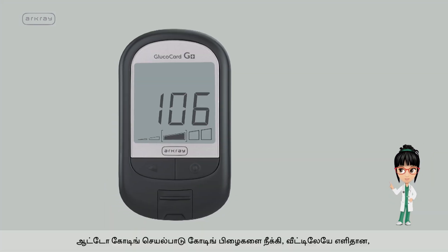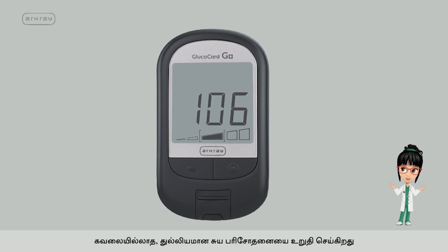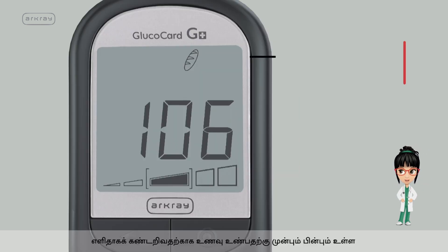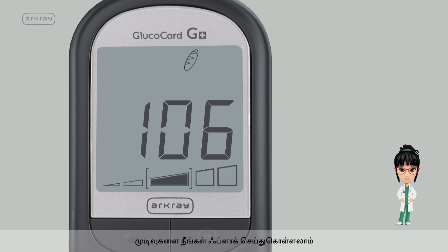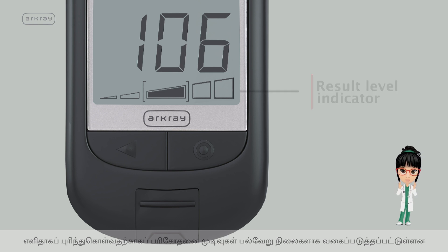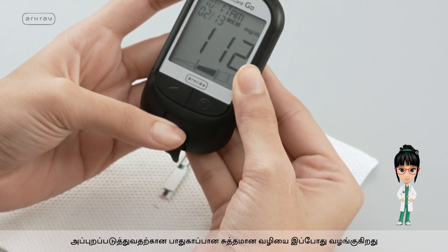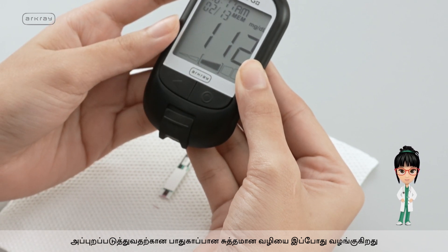The autocoding function eliminates coding errors and ensures easy, stress-free, and accurate self-testing at home. You can flag before and after meal results for easy identification. Test results are classified into various levels through the Result Level Indicator for easy interpretation. The test strip safe eject button offers a safer and cleaner way to dispose of the used strip without touching it.